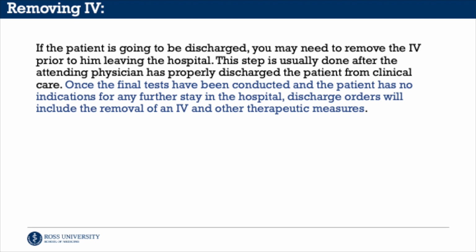In terms of IV removal, if the patient is going to be discharged, you may need to remove the IV prior to them leaving the hospital. This step is usually done after the attending physician has properly discharged the patient from the clinical care. Once the final tests have been conducted and the patient has no indications for any further stay in the hospital, discharge orders will include the removal of an IV and other therapeutic measures as well.